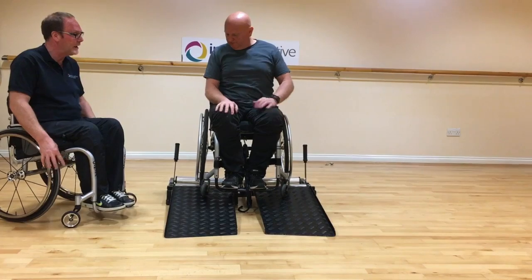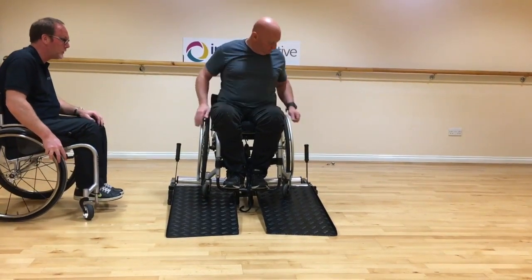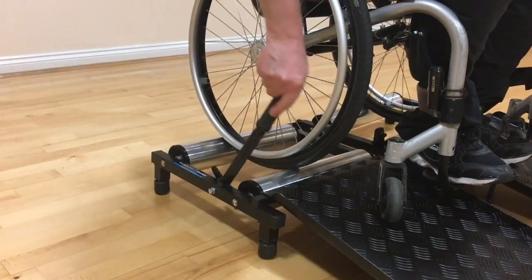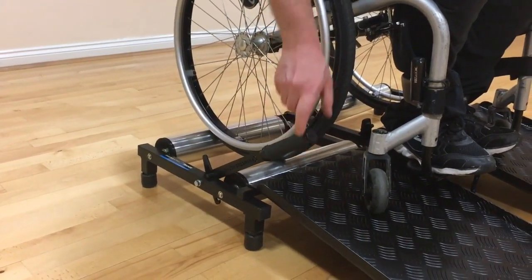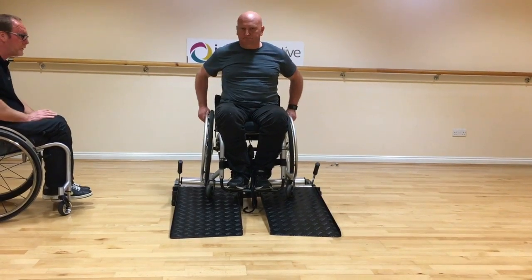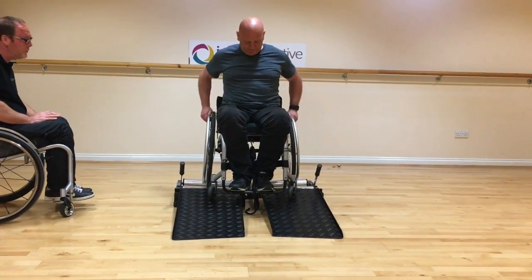Now you're on there nice and secure, take the two brakes off — reach down to each brake and push it forward. It's your first time on there, so just get a feel for it. Get yourself in a nice comfortable position and do a couple of pushes.